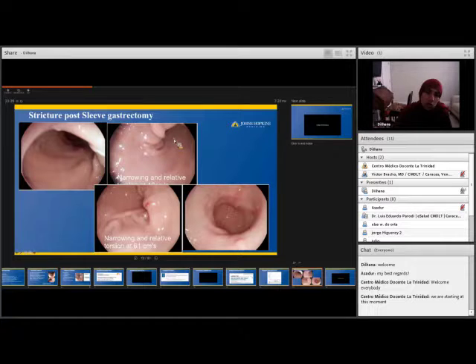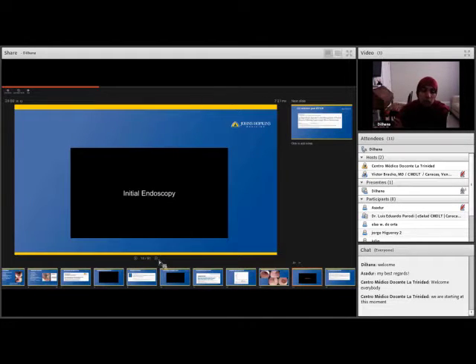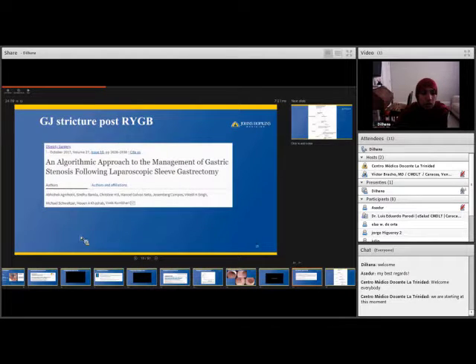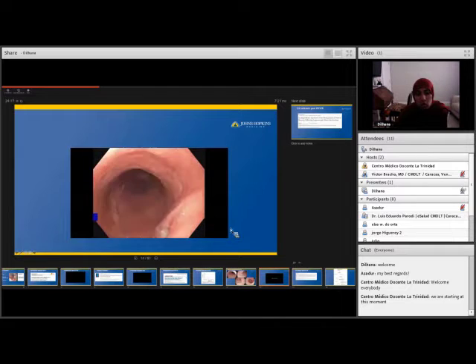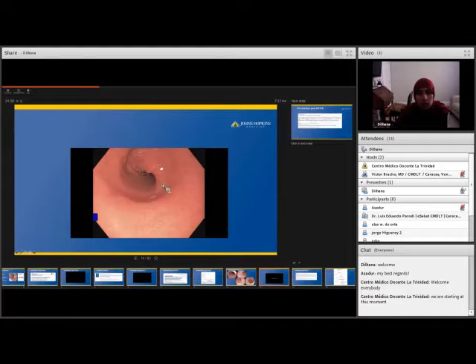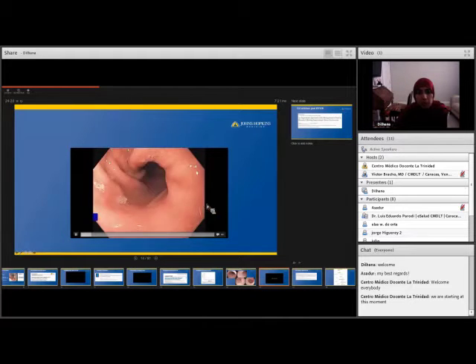So moving on, we're going to talk about strictures post-sleeve gastrectomy. And this can often be identified on endoscopy, but even better on fluoroscopy, or if the patient has an upper GI and a barium. And you can see here in this second picture that there is a relative narrowing right here, but also a tortuosity. You see how the sleeve is sort of rotating inwards right here. And on this picture, again, you see that there's a narrowing right here. You can see here, this is the stapled edge, and you can see that there's a relative narrowing here. But again, you can appreciate that the sleeve is not straight, that there is a slight curve right here. And because of these strictures, patients can present with nausea, with vomiting, and sometimes with reflux.